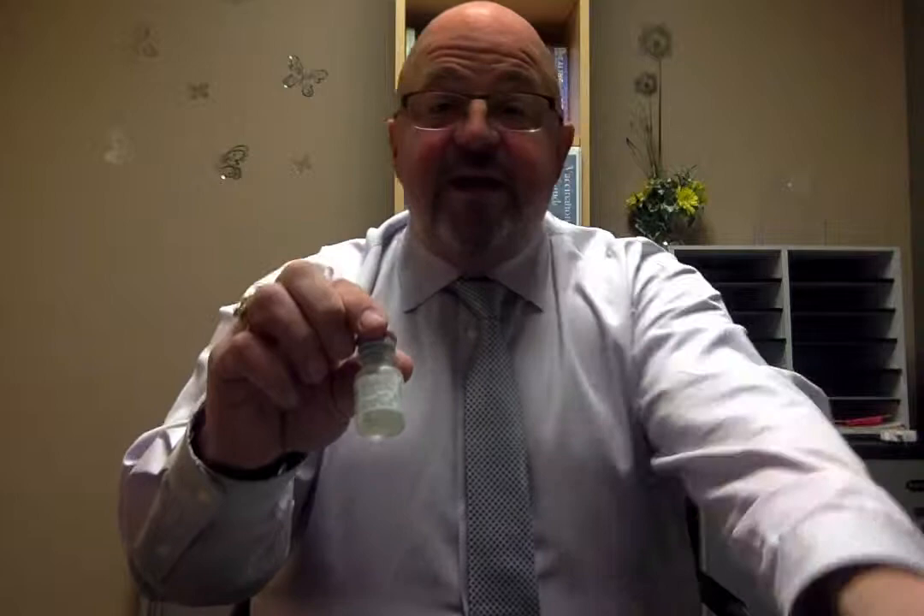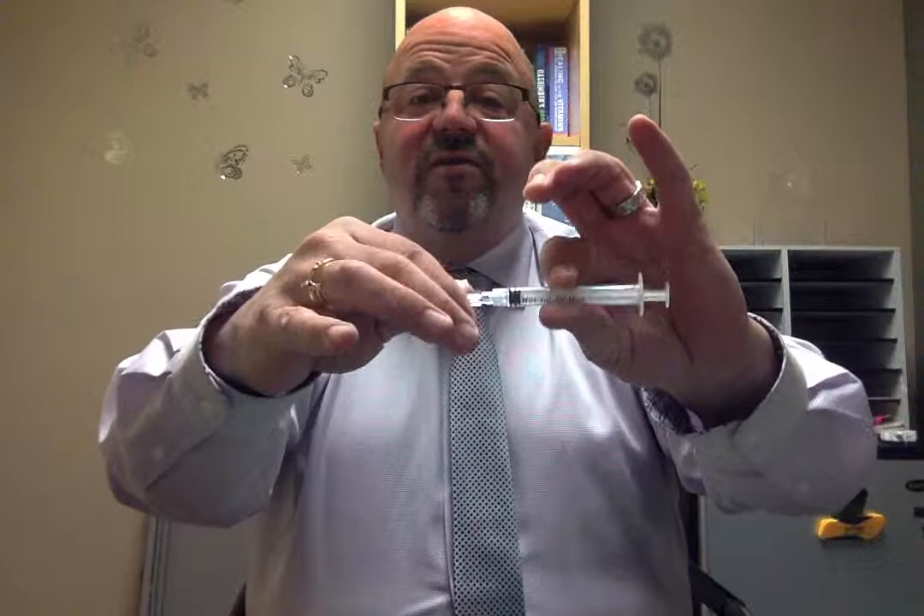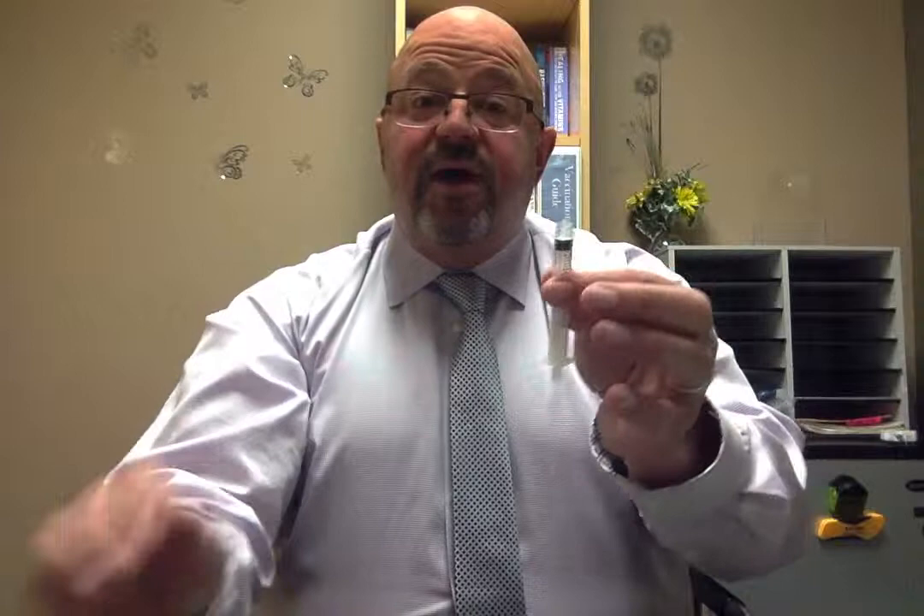I'm not going to draw midazolam up into a syringe and squirt it in my nose because first of all it's a controlled substance, and second of all it's waste. So I'm going to demonstrate with a bottle of saline exactly how you do this. So you have your nasal atomizer — twist off the cap or twist off the atomizer part and set that aside. You have a syringe and you have a needle. You're going to put the needle on the syringe. Take the cap off. Take your bottle of midazolam — again, this is a simulation, so this is just water.